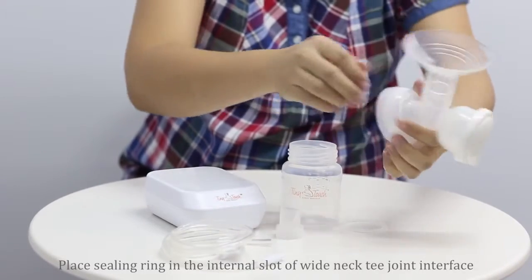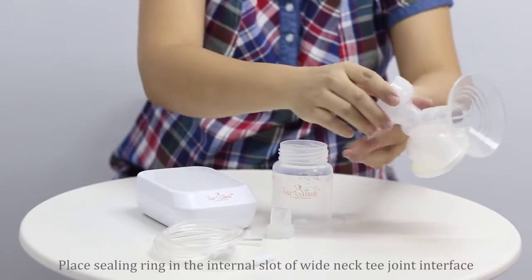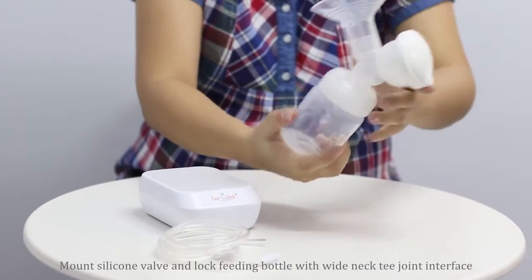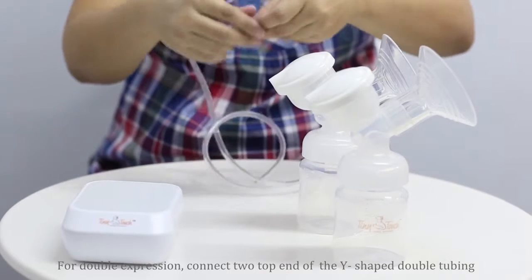Then place the sealing ring in the internal slot of the wide neck T-joint interface. Mount the silicon valve and lock the feeding bottle with the wide neck T-joint interface. Repeat these steps for another breast shield main body for a double expression setup.